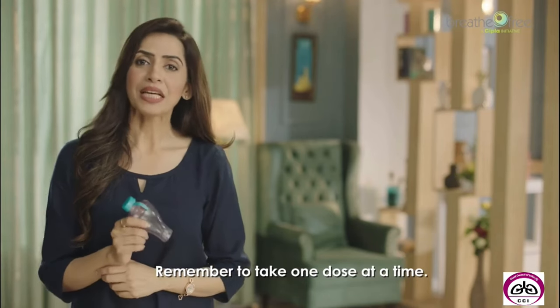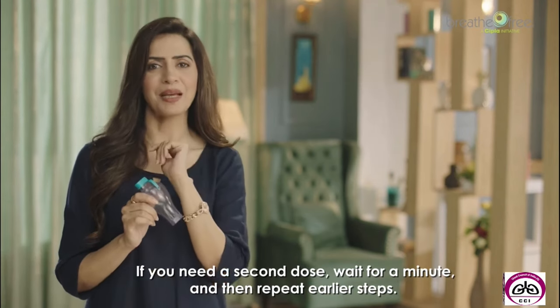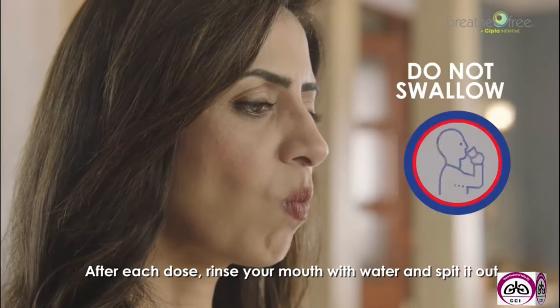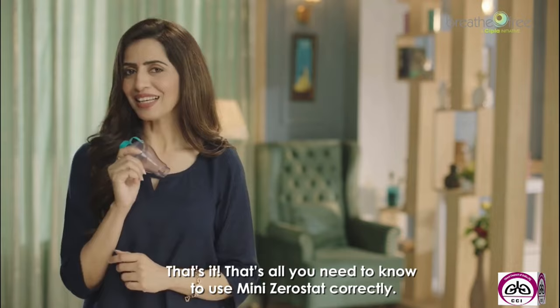Remember to take one dose at a time. If you need a second dose, wait for a minute and then repeat the earlier steps. After taking each dose, rinse your mouth with water and spit it out. That's it. That's all you need to know to use Mini Zerostat correctly.